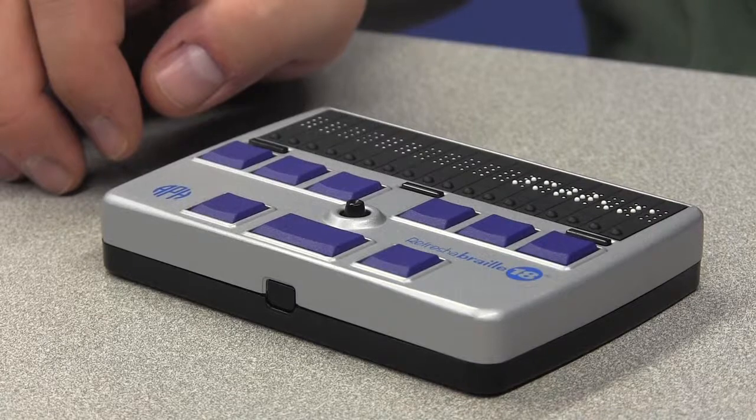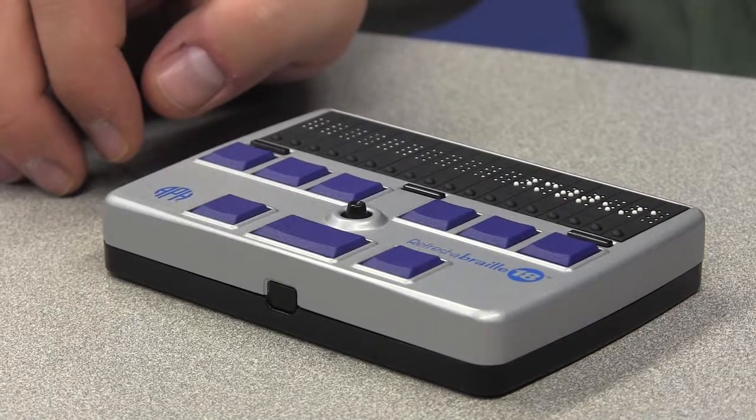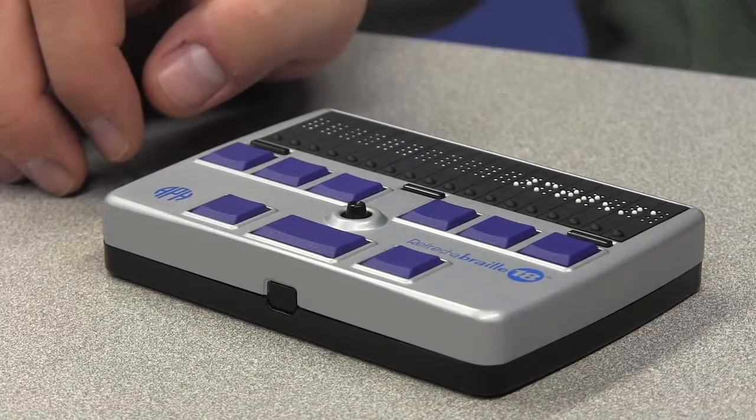The iPad and VoiceOver support multiple Braille devices. Here we'll be pairing a refreshable Braille display with the iPad.